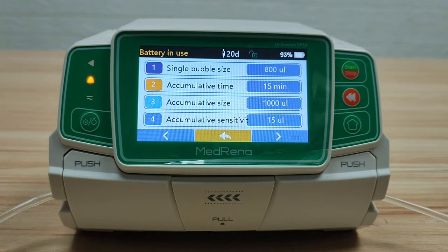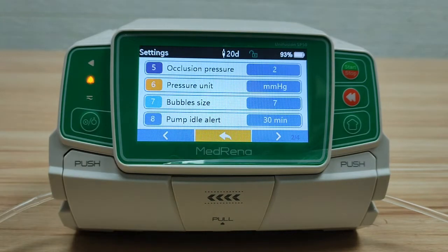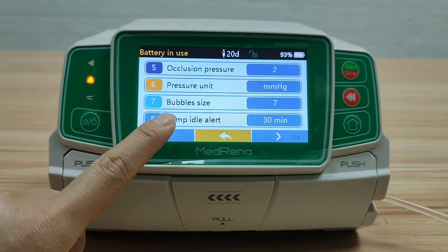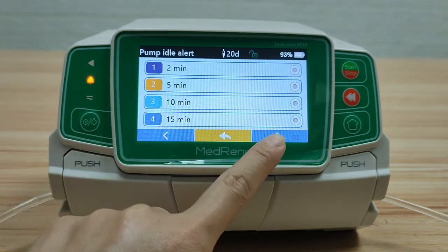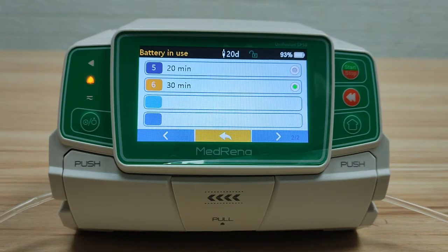The pump provides multiple options for professionals based on different patient populations and clinical situations. Pump idle alert: there are six different time intervals for choosing. When the pump is not operated for a certain period of time, a prompt alert reminds the user.